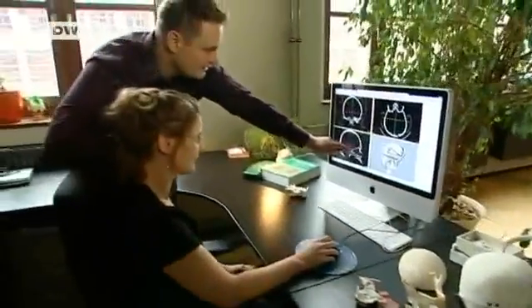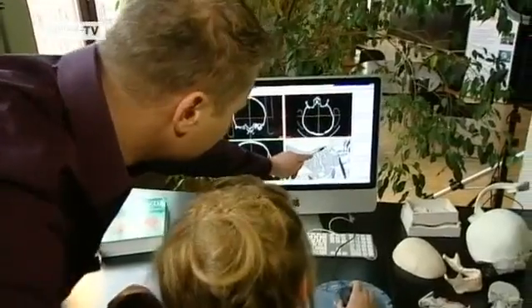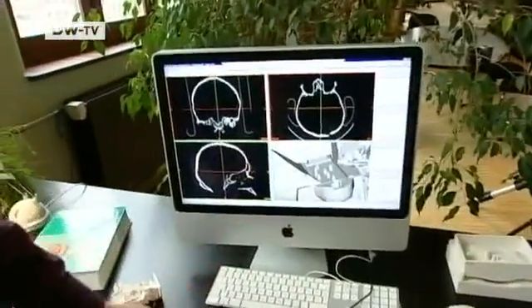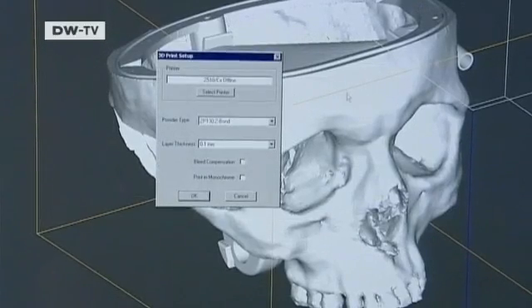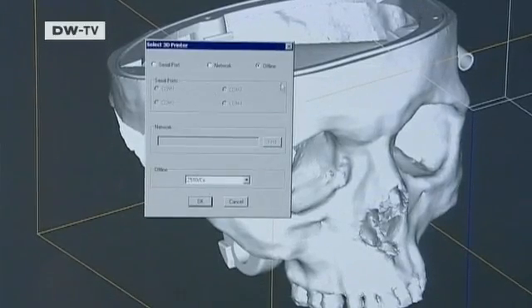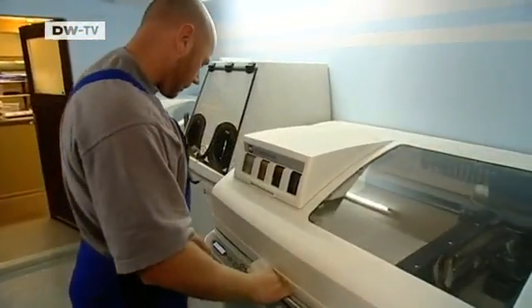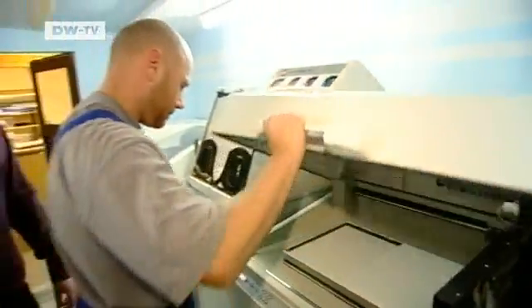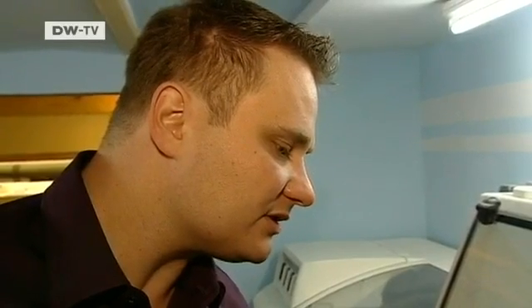The three-dimensional patient model can do lots more. The data is sent to a special printer, which is used to create a replica of the head in plaster. The head is then made in this machine. Layer by layer, the skull is modelled using plaster and a binding agent and then hardened with a special resin. After about seven hours, the technicians have the model of the patient's head in their hands.